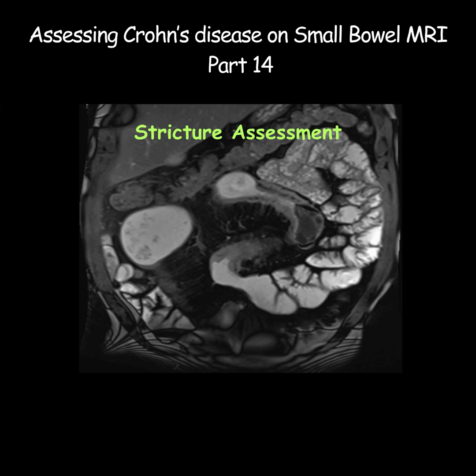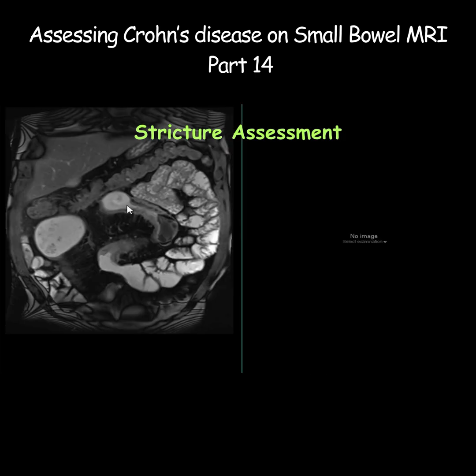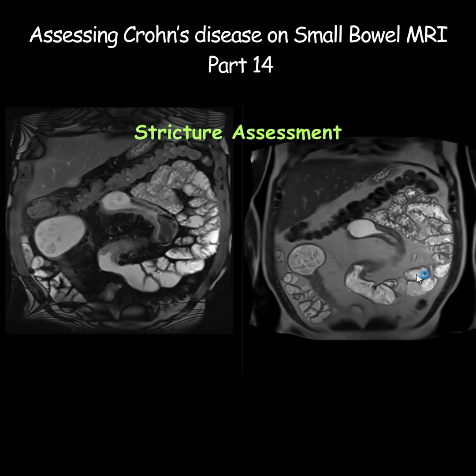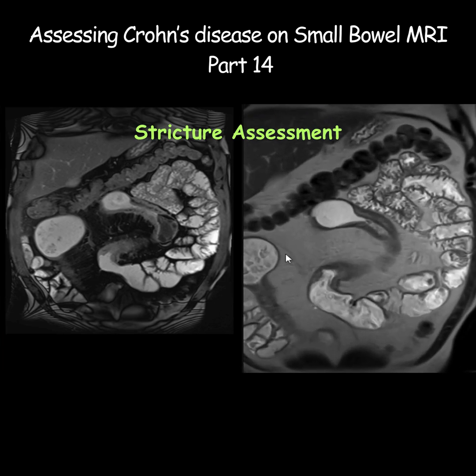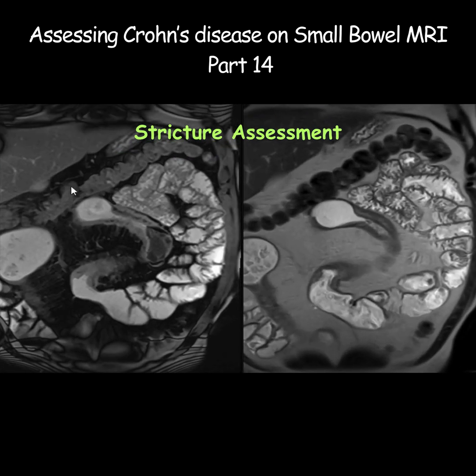We can also compare the T2 signals between the pre and post fat-suppressed images and see what the contents of the structure are. This image is fat suppressed and this is without fat suppression. Now you can see the abnormal bowel wall thickening — can you see the difference between the two?